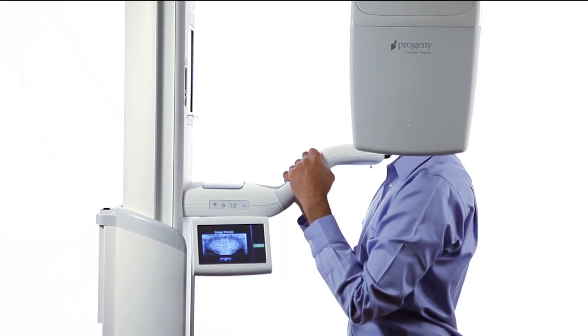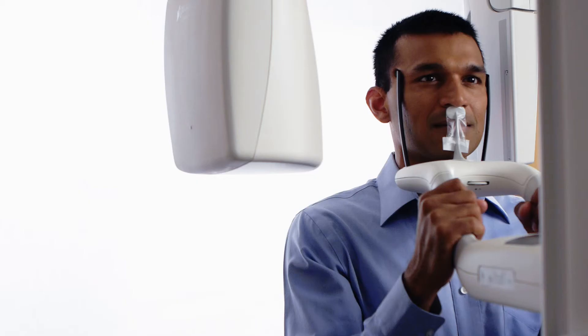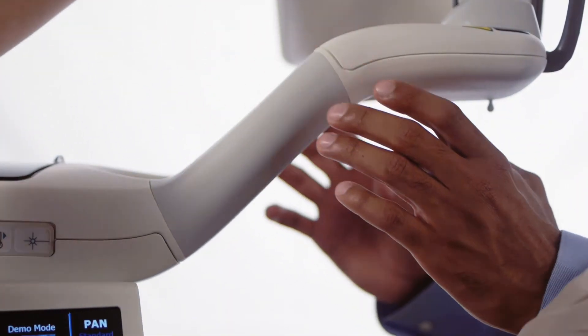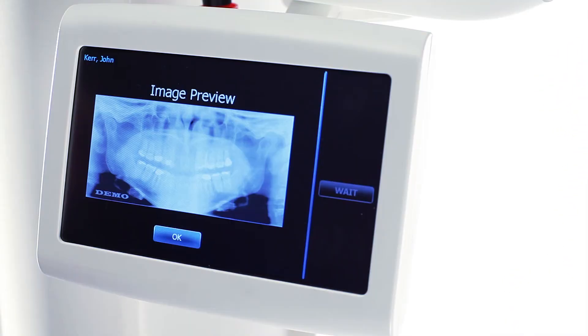At the end of the exam, the overhead structure drives to the patient exit position. Advise the patient to remain in place until the overhead comes to a complete stop. Assist the patient in stepping back and out of the structure. Tap OK to accept the image.